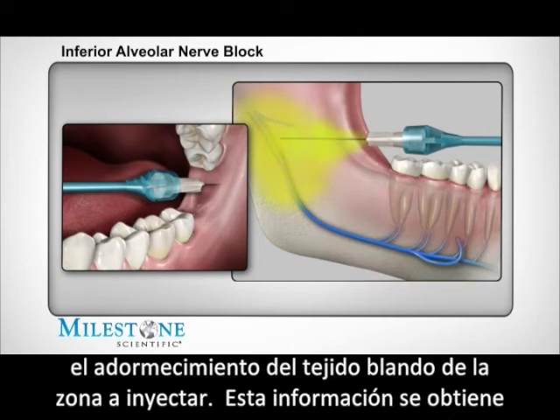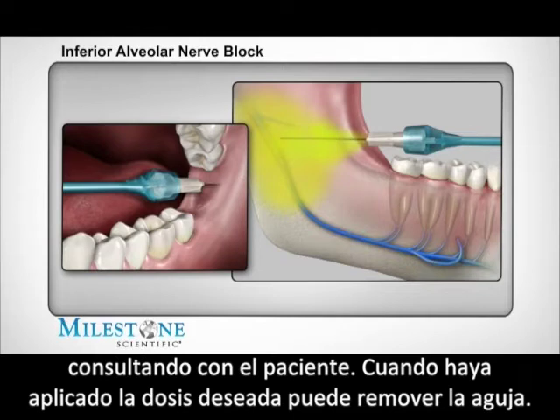This is acknowledged by subjective statements elicited from your patient. When you've delivered the required dosage, you can remove the needle.